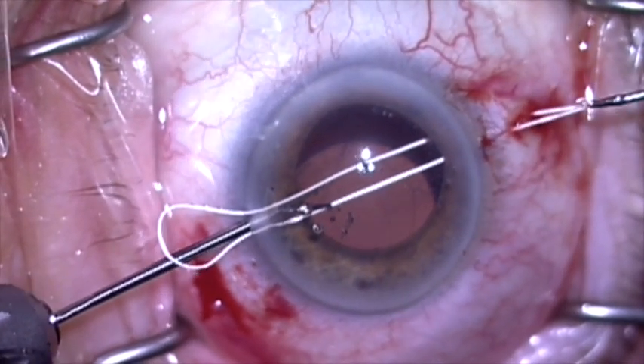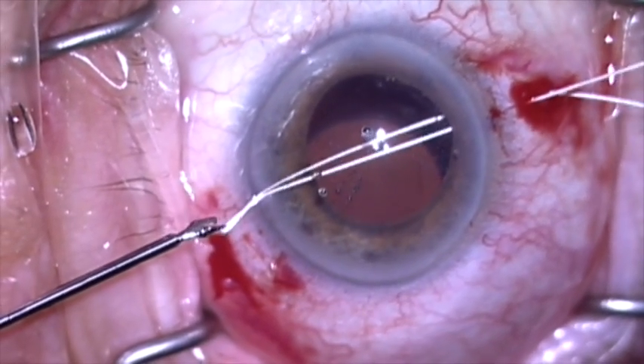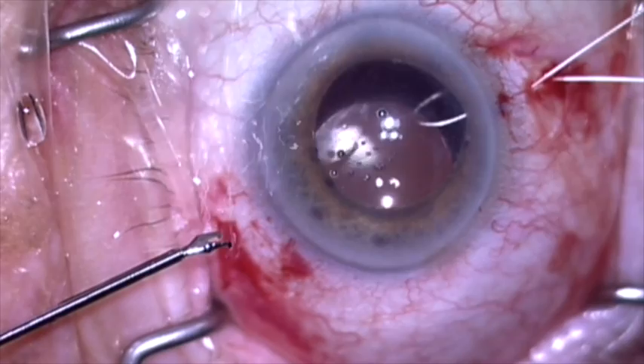The suture is now retrieved on top of the haptic, so it is wrapped around the haptic through the capsular bag, lassoing the haptic.